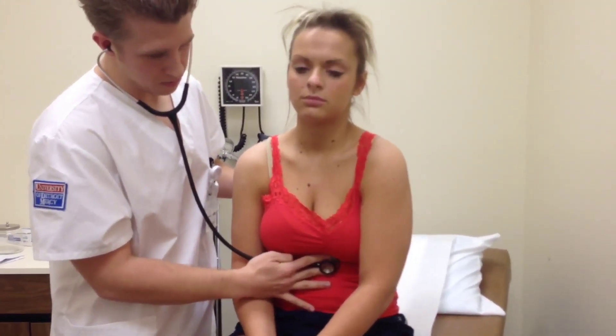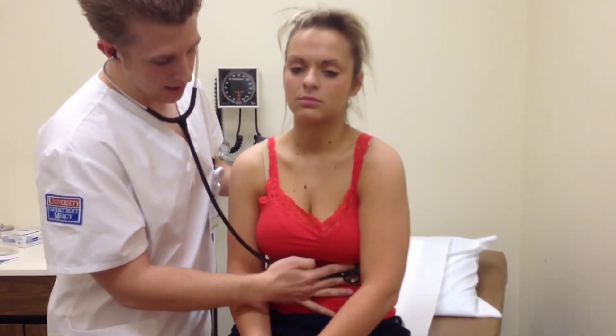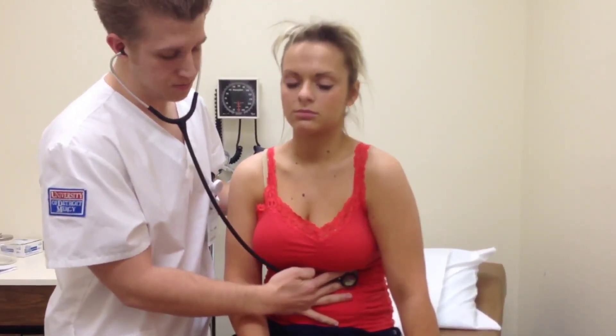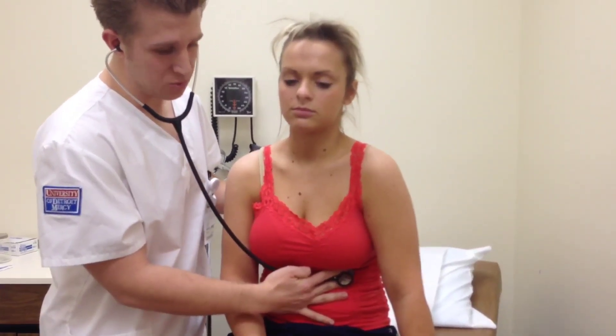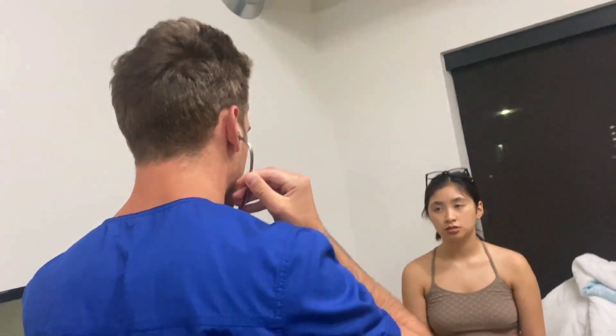That is the tricuspid area, and then to the mitral area where S1 is heard the loudest. I would hold and listen for 60 seconds for the apical pulse. Then I would change my stethoscope to the bell and move back up in the same direction that I went down.